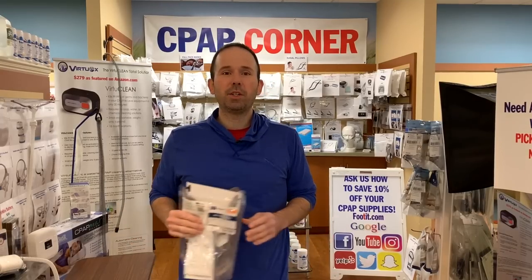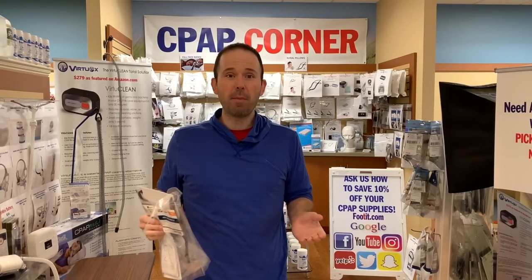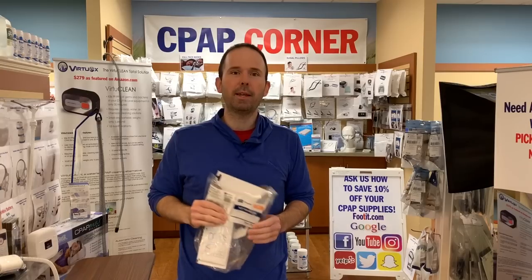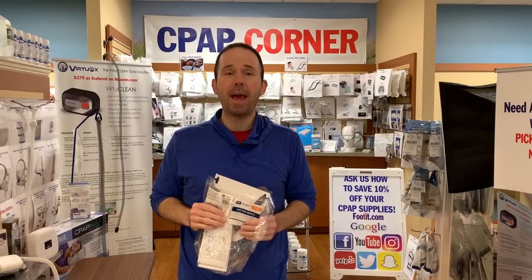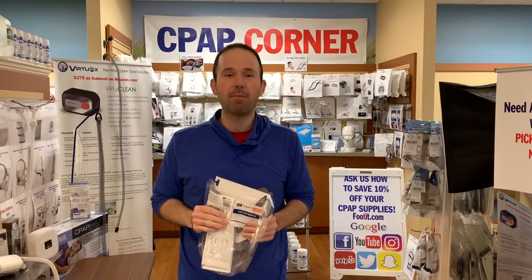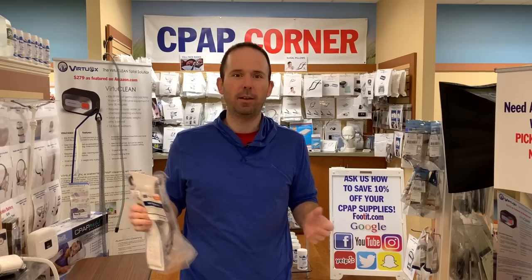Hey, what's going on guys? Rich here at CPAP Corner at Footit Medical. Today I'm going to be reviewing the Fisher & Paykel Simplest Full Face CPAP Mask. Let's get right into it.